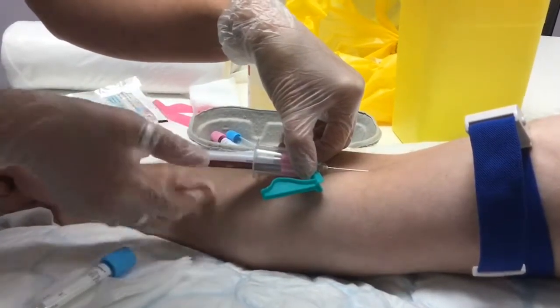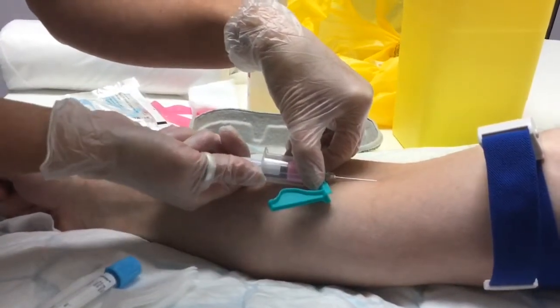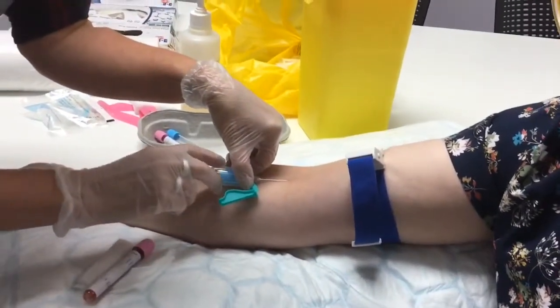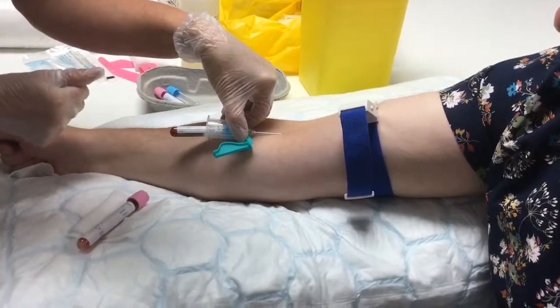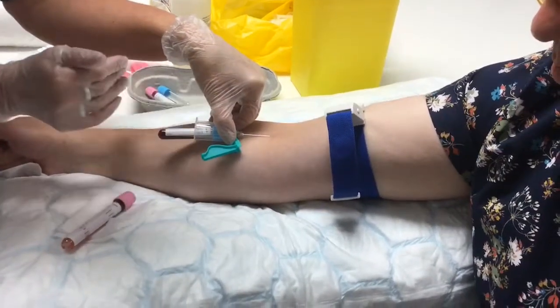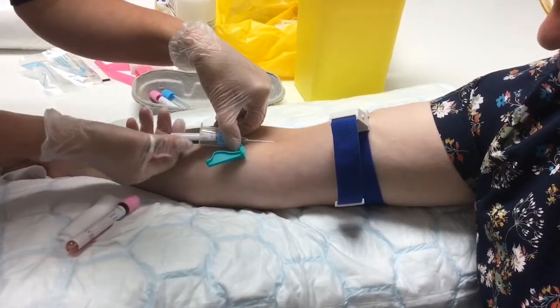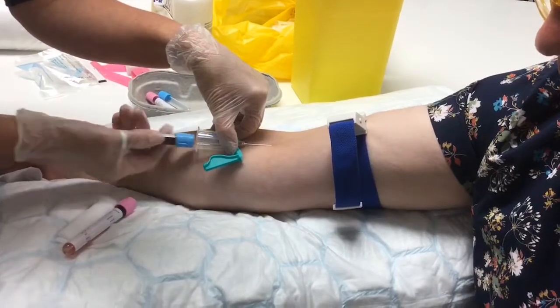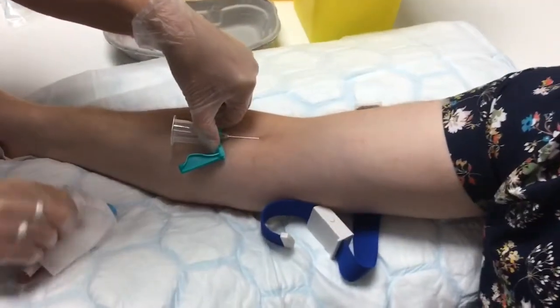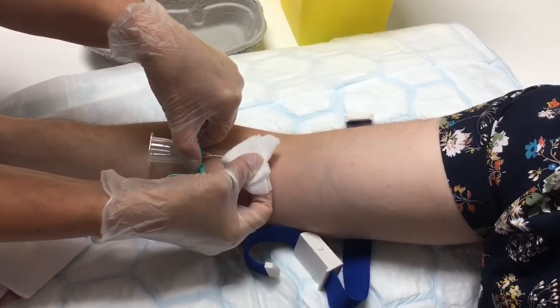Fill it right to the brim — I'm not going to do that here as this is a demonstration. Hold the bottle and push your thumb against the vacuum container so your needle stays nice and still. Get into the habit of doing it a couple of times. Hold that firmly. My hand is steady and the needle is steady, because what can happen is the needle can go in and out — you don't want that. So hold the blood bottle, push against the vacuum container.